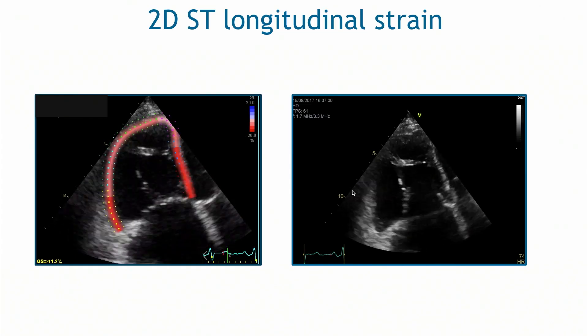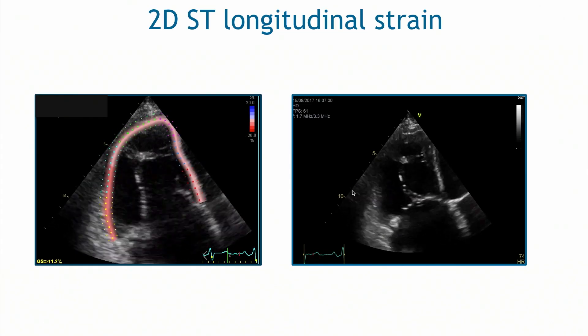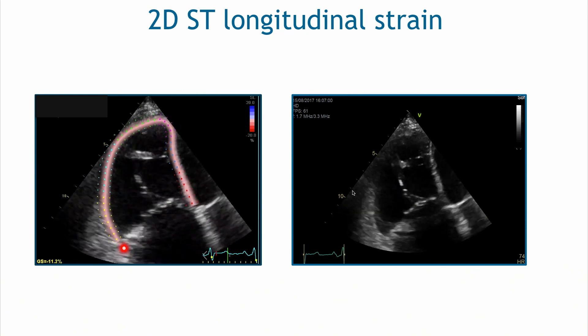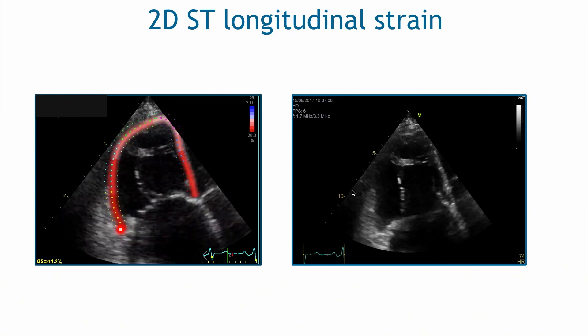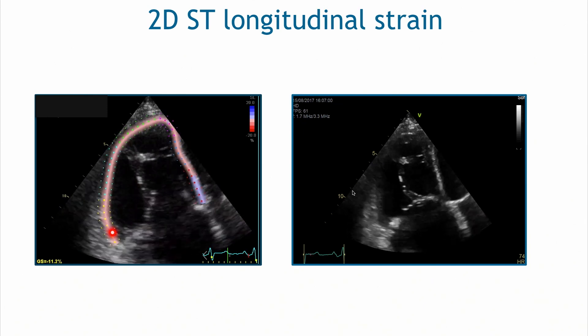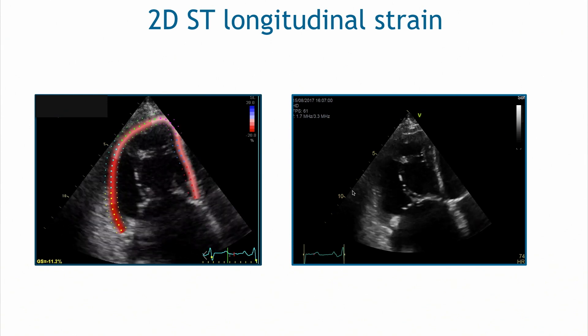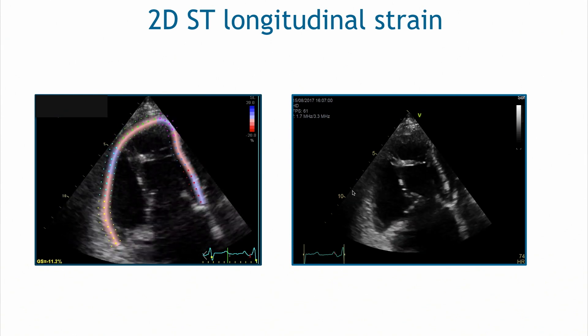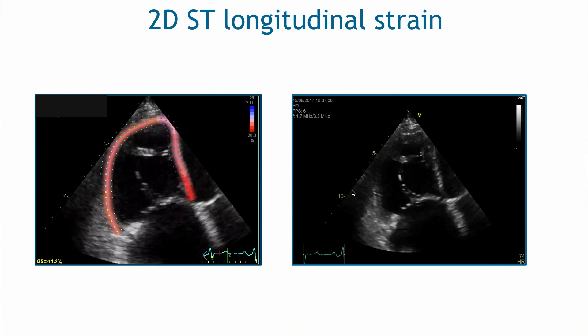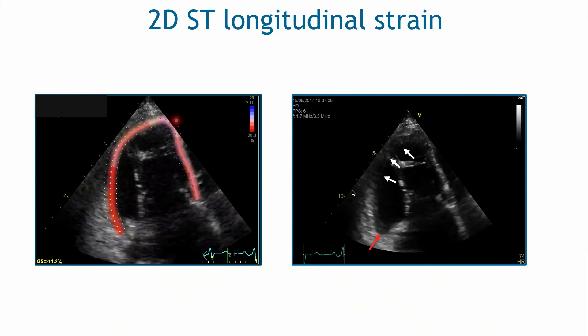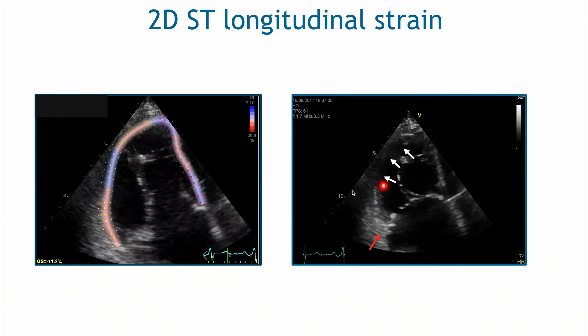Why do we have normal TAPSE and normal S' prime yet reduced longitudinal strain? If we carefully look at these images, we can appreciate that the longitudinal displacement of the basal part of the right ventricle — close to the tricuspid annulus, exactly where we perform measurements of TAPSE and S' prime — is relatively preserved. However, it is absolutely clear that the mid and apical parts of the RV free wall are contracting very poorly.